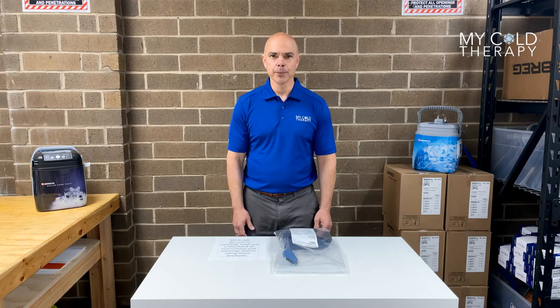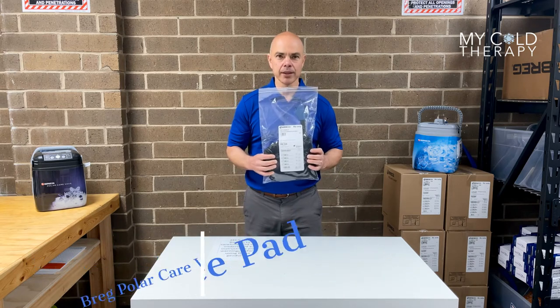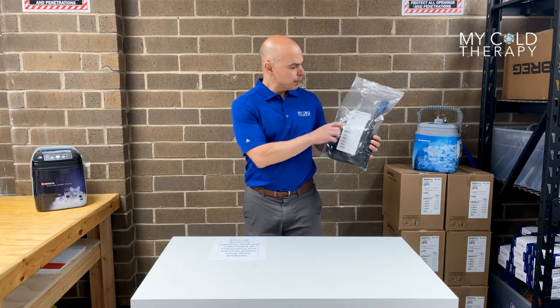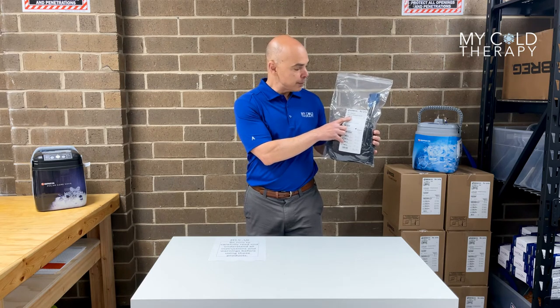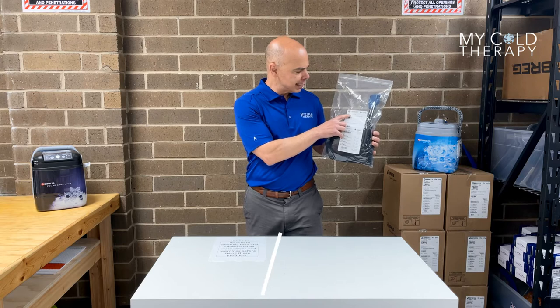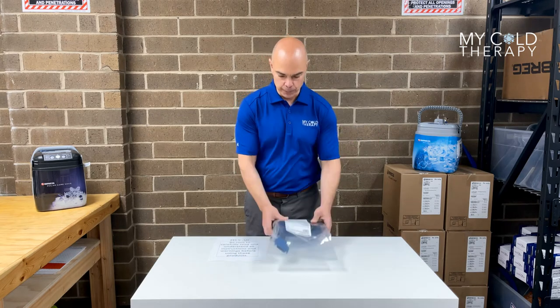Hi, my name is Steve from My Cold Therapy and today we're going to talk about the Breg Polar Care Wave Pads. This is what it's going to look like when you get it in the mail. First thing you want to do is check the part number on the front. This is the Breg Wave Knee Pad — part number C00017 — that way you know you have the correct pad.